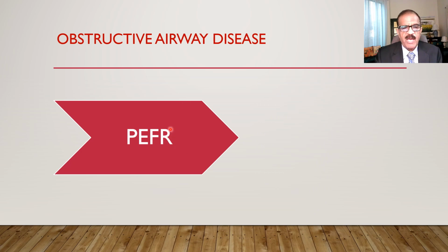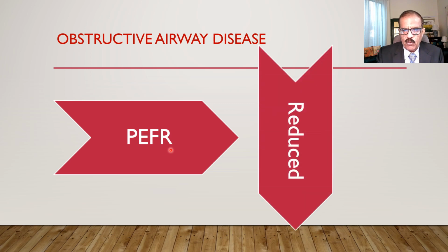Similarly, if you use peak flowmetry, the equivalent of spirometry, peak expiratory flow rate will of course be reduced. Not just one measurement, you can monitor these patients and see how things are improving or otherwise. So this is the advantage of pulmonary function test.